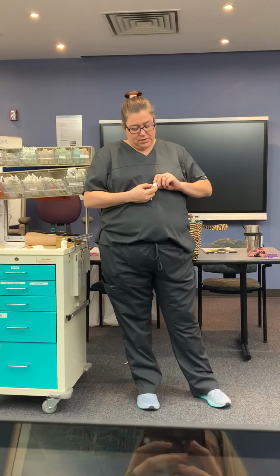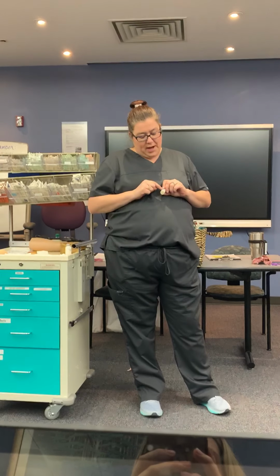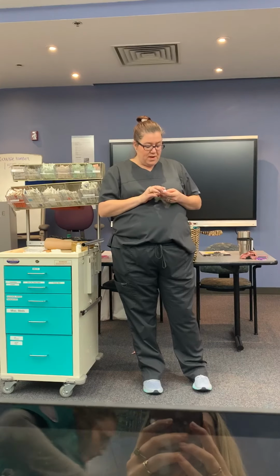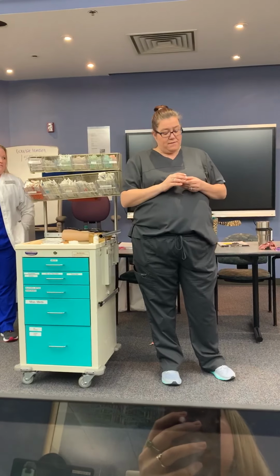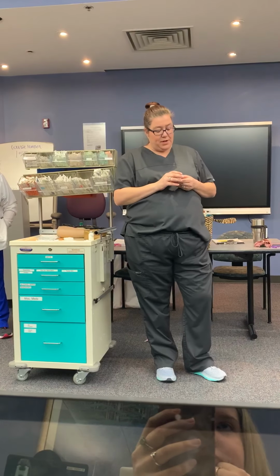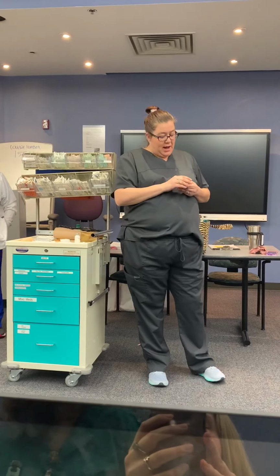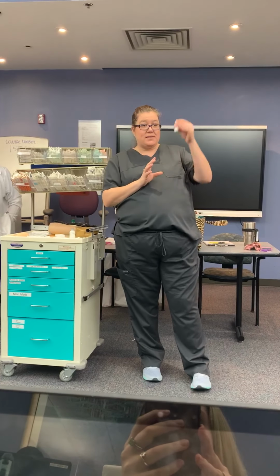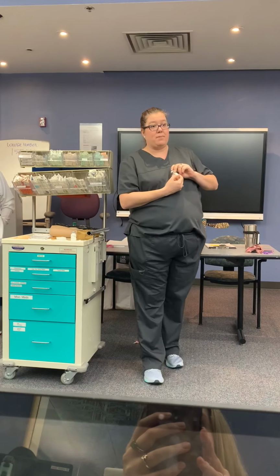So on this vial, it will tell you how much saline to put in, and then how much you're actually going to have for however many milligrams. If we're going to do the smallest amount, it would be 500, the most concentrated, 500 milligrams per mil. We're going to add 3.6 milliliters of diluent, which in this case is normal saline. And then the reconstituted solution volume should be 4. So we're going to add 3.6 in here, but we should be able to pull out 4, and that's going to give us our 500 milligrams per mil.